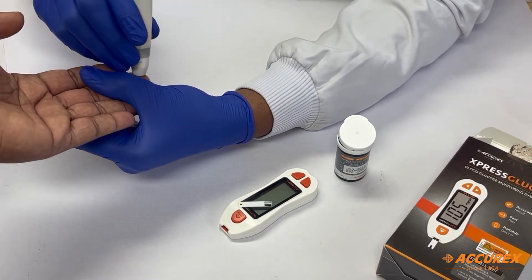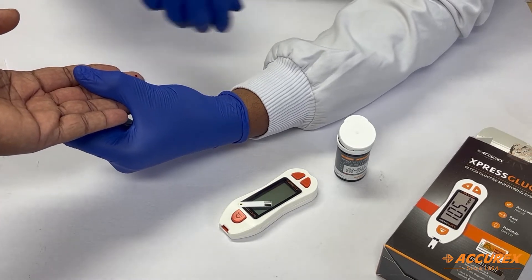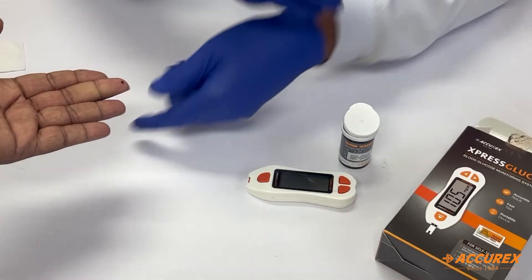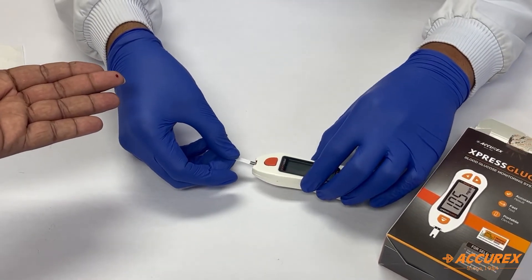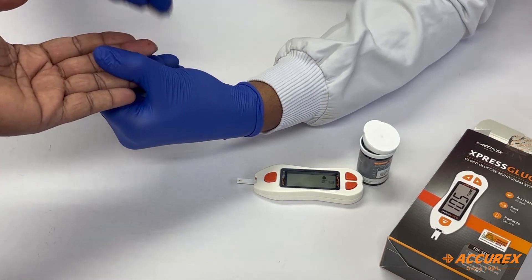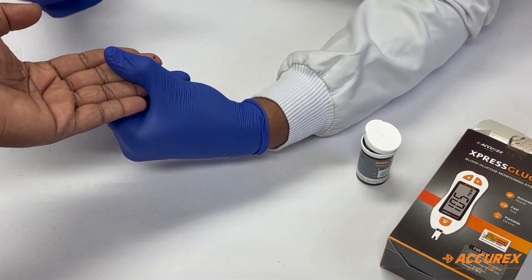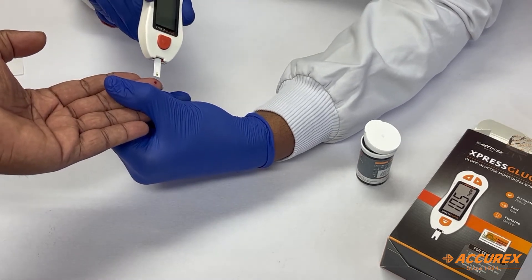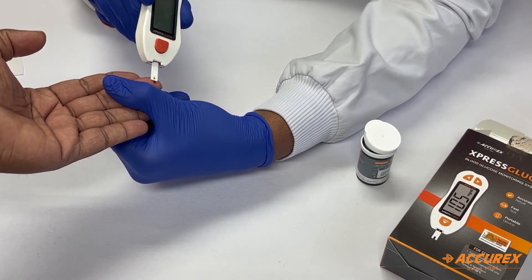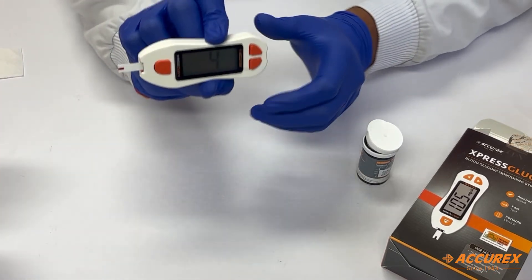After drying, prick the finger with the lancing device on which we have placed the lancet earlier. After pricking, place the strip inside the meter and wipe out the first drop of blood for accurate results. Then place the tip of the strip onto the finger — it will suck the blood automatically.